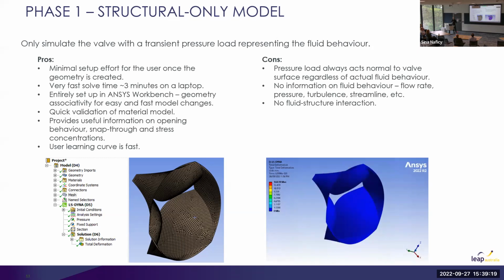Make sure it's basically behaving as you'd expect it. So you can eliminate garbage designs very quickly. Also, the user learning curve is very fast. So you can teach someone to do that very quickly.